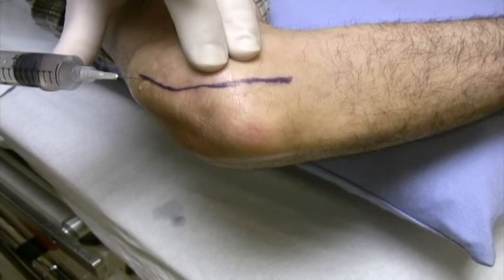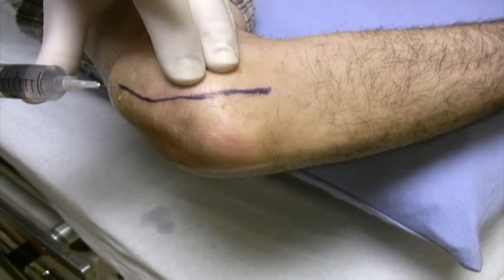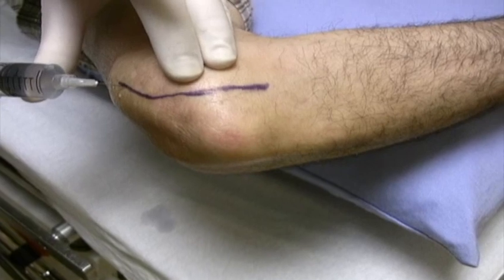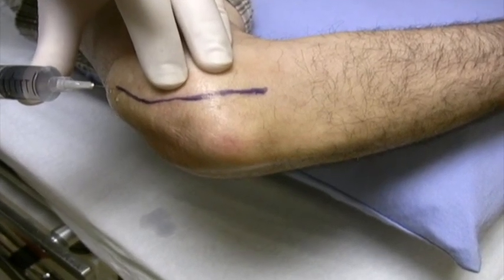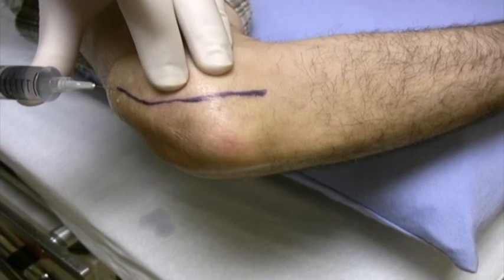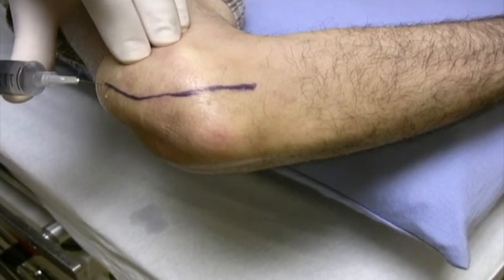In the last few years, we've stopped doing our ulnar nerves in the main operating room. For one thing, we're not transposing them nearly as often, although you could still transpose them with field sterility. But 70% of Canadian carpal tunnels are now done with field sterility outside of the main operating room.